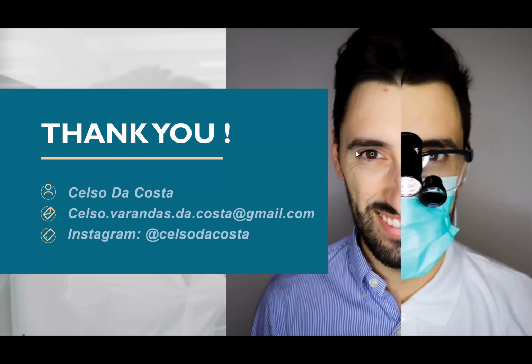A question about the lamp, from Raquel Silva. Do you get better results with the Blanc One lamp than with other types of lamp, or can curing lamps be used? What's your opinion? The thing is, you need a lamp with the same wavelength as the photosensitizers. So the Arcos lamp, the Blanc One lamp, is the best one because it has a wavelength between 430 and 490. If you are using a Zoom lamp, it's not within this interval. And the thing is, with the Zoom lamp, you need to get the attachments for patient treatment.